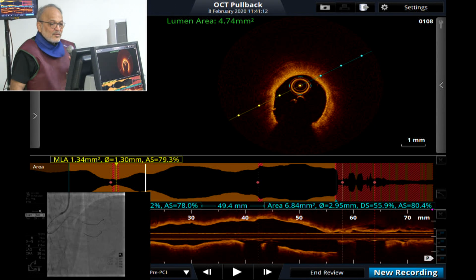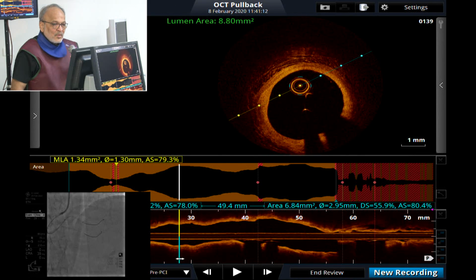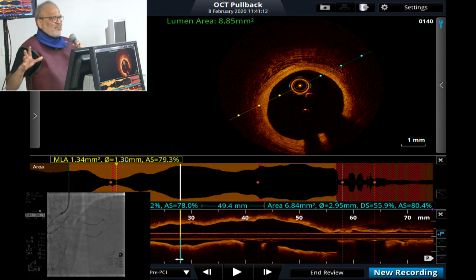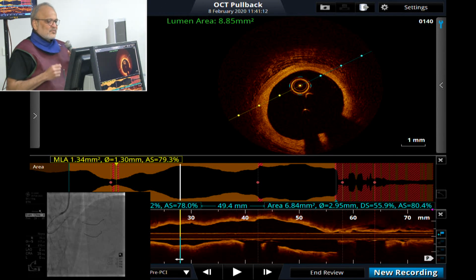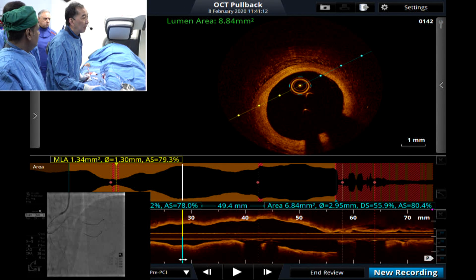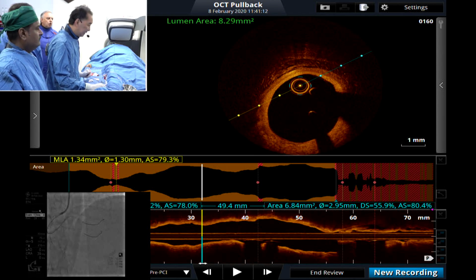Tejas, have you used side branch imaging to determine side branch size before stenting and determine whether you would pre-dilate? We usually do that only for left main bifurcation when there are big arteries, not otherwise. If we decide on a two-stent technique, I think I need to image the side branch too. If we do a provisional, usually I don't, because after your balloon dilation the PDA looks okay. Let me review the angiogram. I haven't seen it clearly.